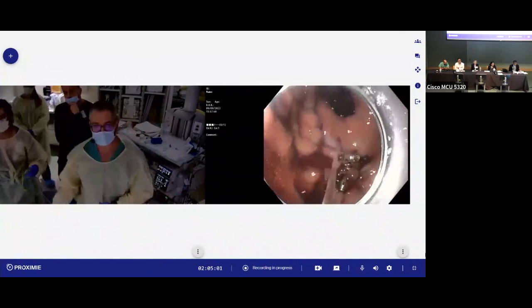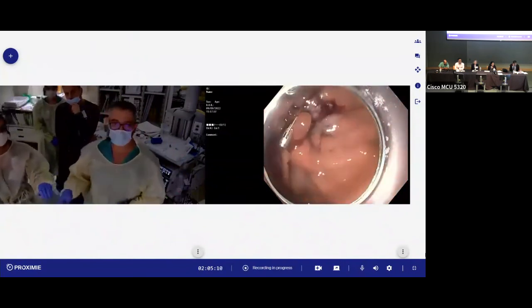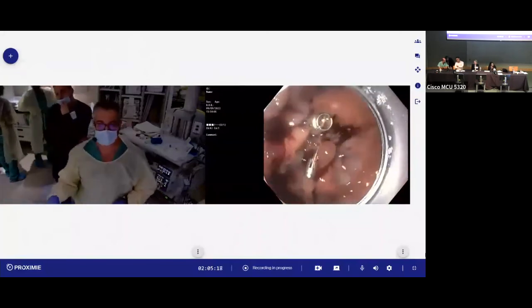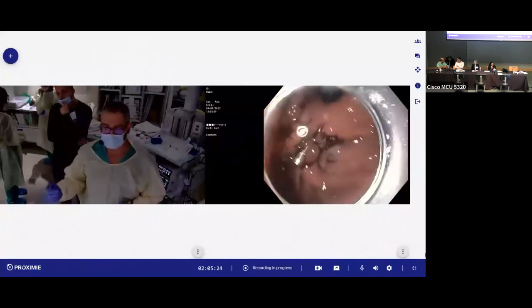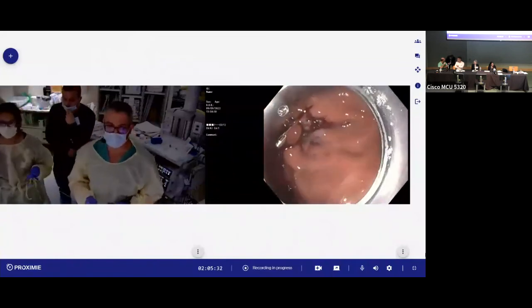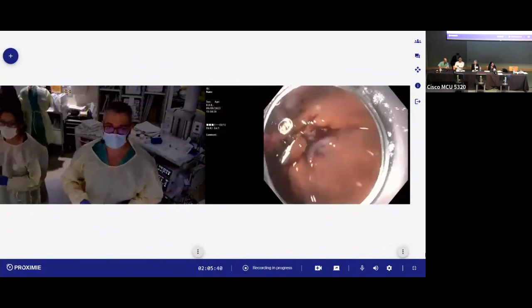So it's a very neat way of closing, and it requires even way fewer clips than the regular method. For the small area here, we're going to use an Instinct Plus clip to close that defect, and if I do the third clip, we'll have a complete closure. So closure versus no closure is not only for bleeding, but also for post-polypectomy syndrome. And I worry more, the more of these cases I do and use cautery, especially when you do EMR and deep resection like that, you worry about post-resection syndrome. So closure protects against that.